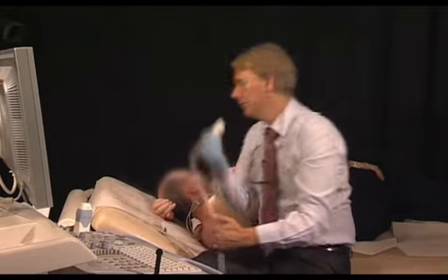It is equally important to look at the right ventricle when we look at patients with cardiomyopathy. So we'll start with the 4-chamber view.